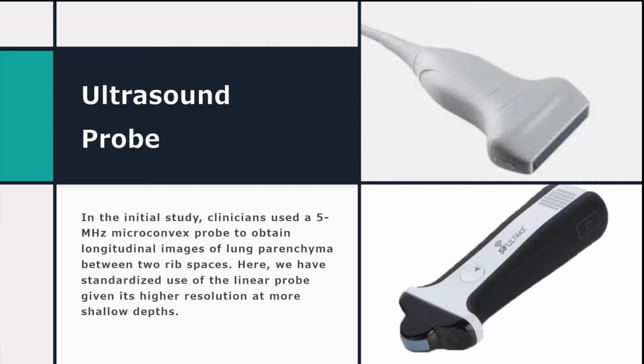And there's a part of the algorithm that asks you to do a vascular exam, and it's very efficient for looking for DVTs when you do compression of the veins. So here we always use the linear probe, and we use it in a standardized way for lung exams and vascular exams, and it works essentially the same.